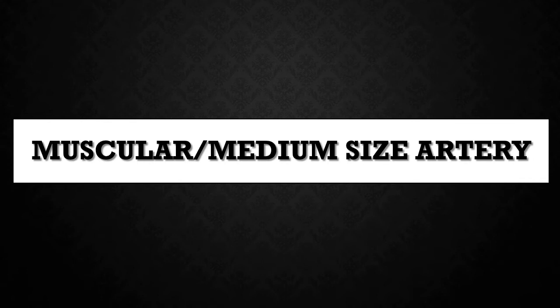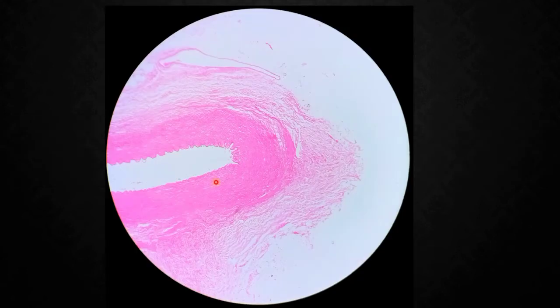Medium size artery or muscular artery. How to identify that medium size artery? Blindly, how to differentiate without seeing it? You can see a big part of the artery, so that is nothing but the medium size artery or muscular artery. In the large size artery we can identify only a small part of the artery, but in the medium size artery we can see almost half of the artery in the histology slide in the 10x.